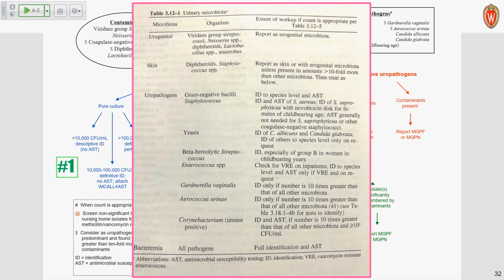Next slide. And this flow chart is based on the Clinical Microbiology Procedures Handbook, which has a new edition that came out last year, I think. What is it, 4th or 5th? I think it's 4th. 5. We have an author right here, right? So that's the 5th edition. Al knows everything about that. So that's essentially the basis for generating this god-awful looking algorithm for working up a urine. It's based off of ASM and clinical microbiology literature.